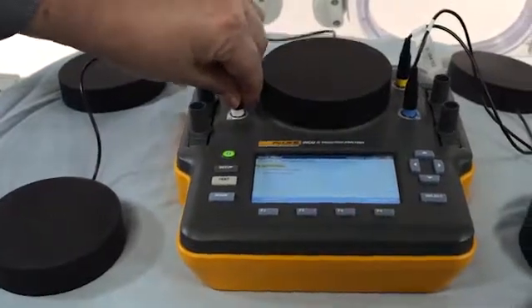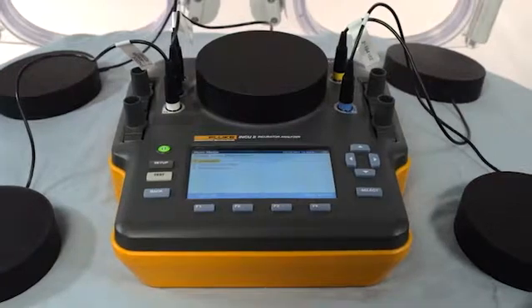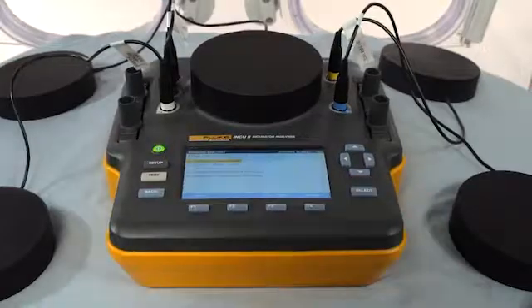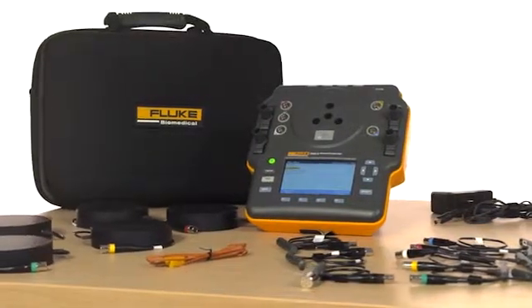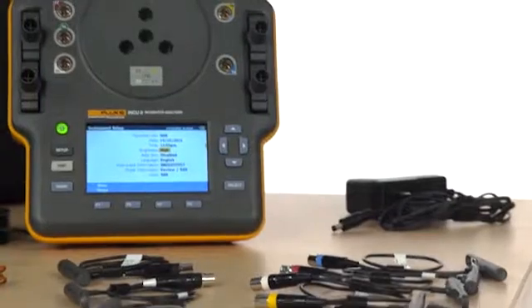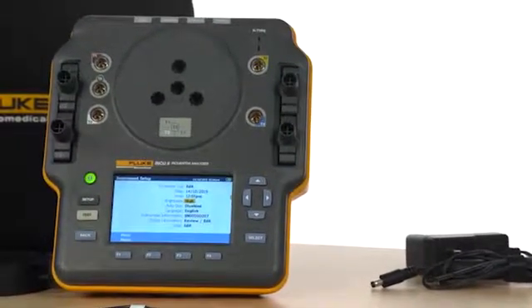To test radiant warmers, simply replace the temperature probes with the radiant pucks. Position them around the warmer according to the standard, then select the appropriate test and testing environment. We've designed the INQ-2 to not only be highly portable and easy to use, but to give our customers a best-in-class, all-in-one solution. The INQ-2 is compliant with all global IEC standards for radiant warmers, incubators, and transport incubators.